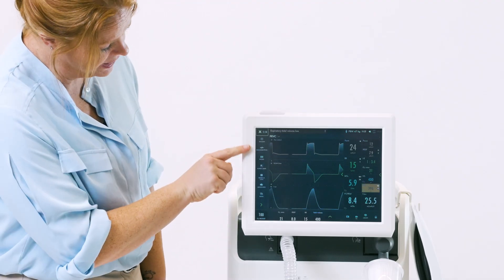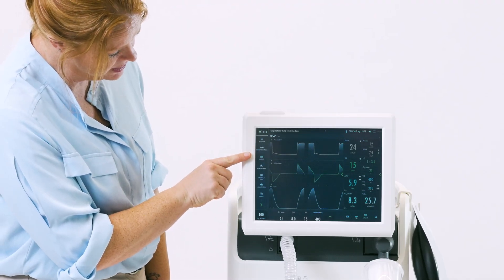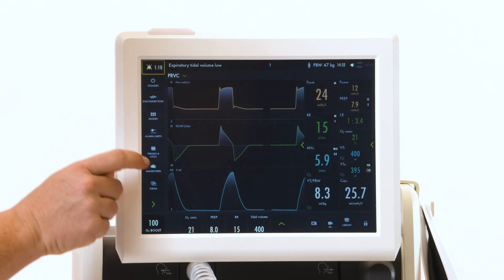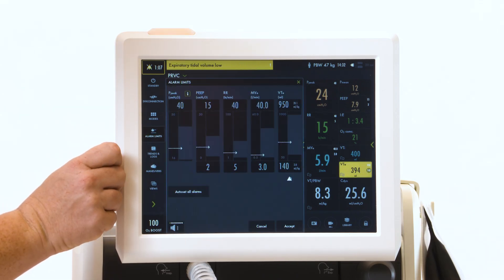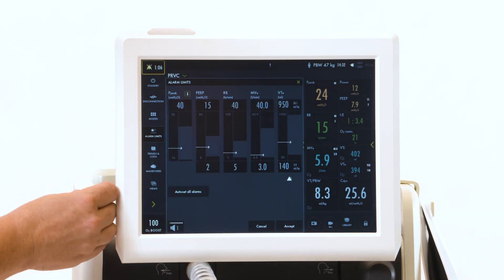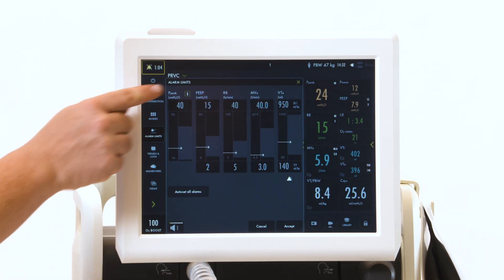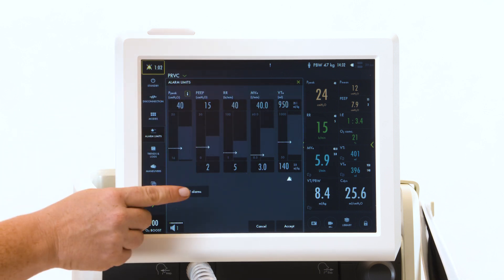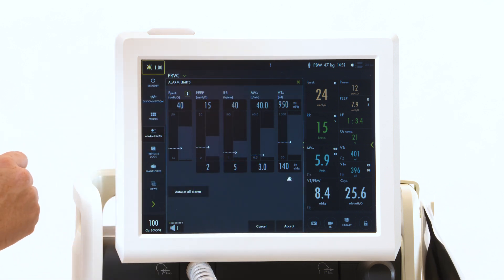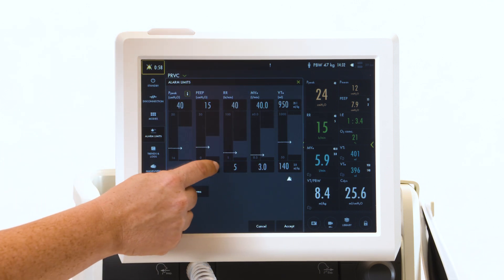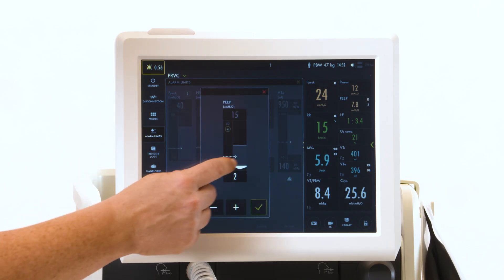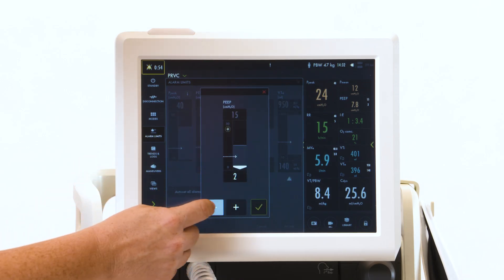Your alarms are located underneath your tab entitled alarms. When you touch it, it will bring up all alarms that are available in that mode. The top being anything high and the bottom being anything low. To make adjustments, touch that alarm and pull down or add and subtract.